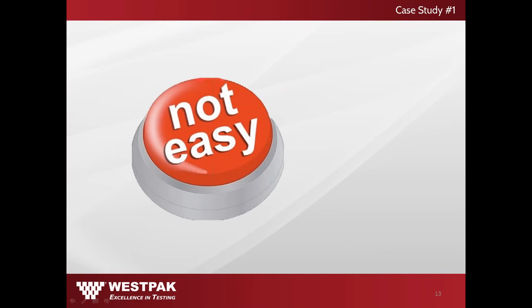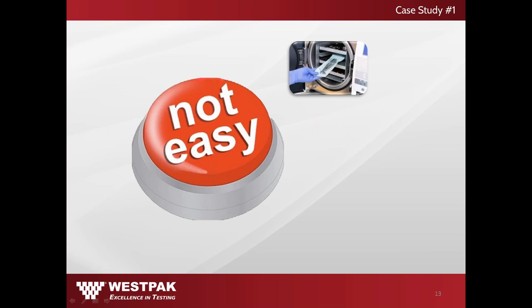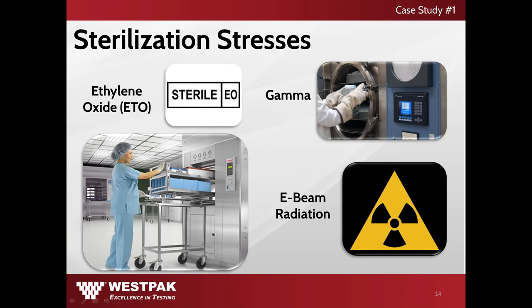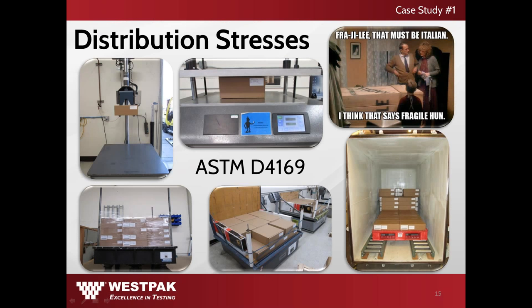Creating a successful package design is not always easy. Factors such as sterilization, distribution, and environmental stresses need to be considered. It's important to ensure that the sterile barrier is not compromised. Sterilization processes such as ethylene oxide, gamma sterilization, and e-beam radiation can all impact the integrity of the package system. It's also important to understand the distribution stresses the package will be subjected to. In ASTM's package performance standard D4169, a distribution simulation test sequence is followed.